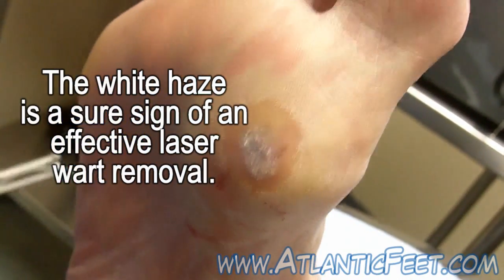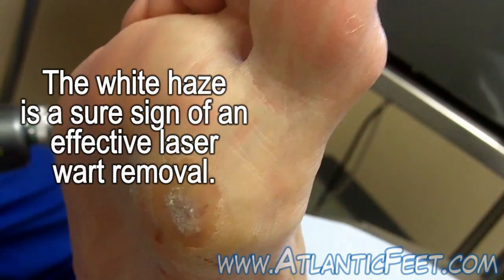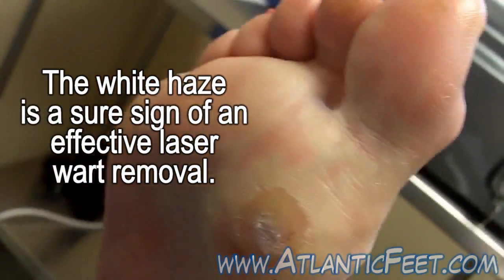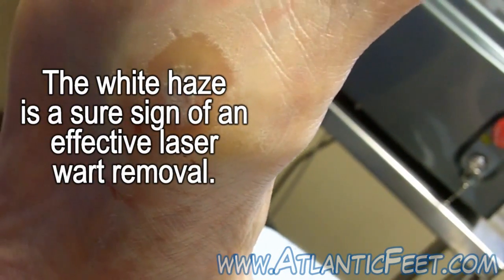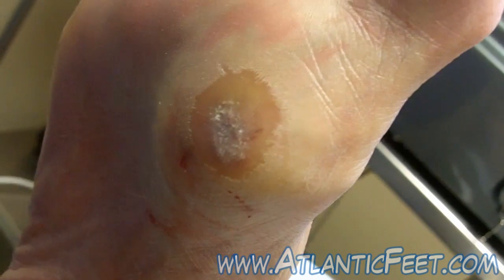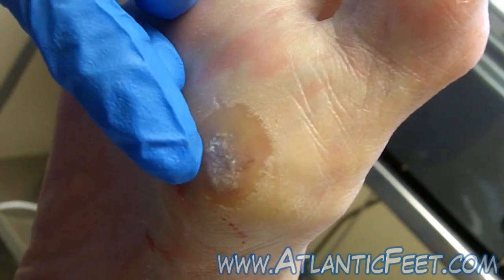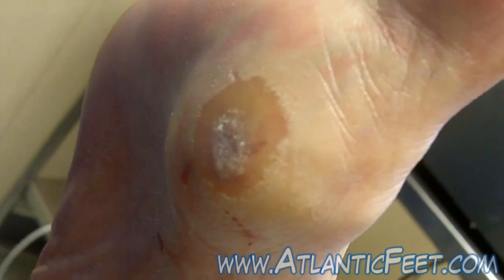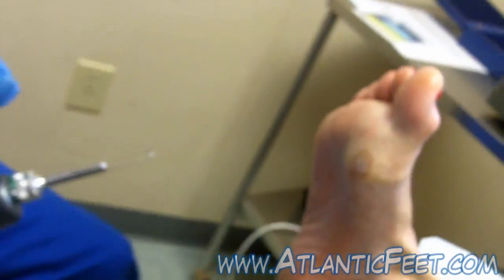You're at level four, three hertz — and four hertz is the highest — so I think that's good. I don't want you to feel anything warm through the numb. All the white ashen area is what you want to see. I took it out a little bit further because she had some tissue that didn't look quite normal, so we got around that edge as well. We'll see how she does in about a month.